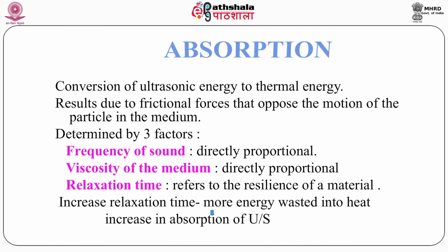The next type of interaction is absorption. It refers to the conversion of sound energy to thermal energy. The factors which determine the amount of absorption: first is the viscosity of the conducting medium. Ultrasound absorption is directly proportional to the viscosity of the conducting medium. The more viscous the liquid, the more the attenuation.